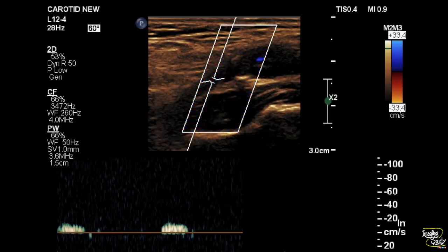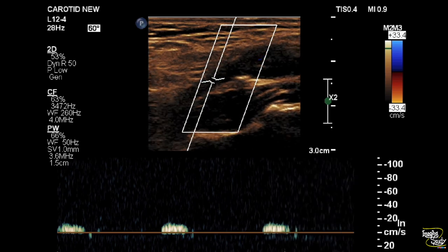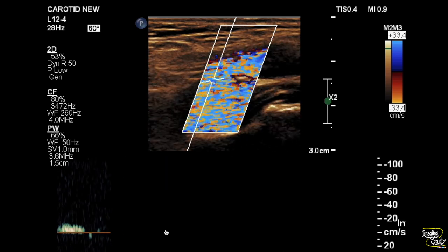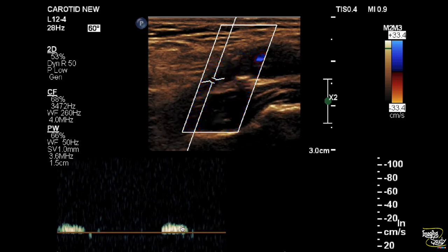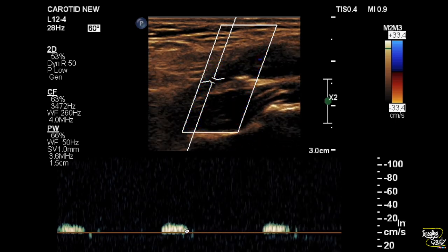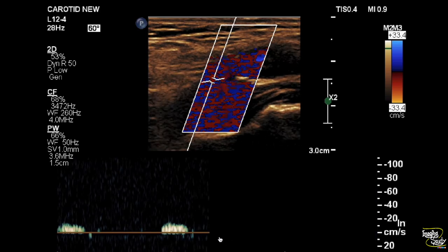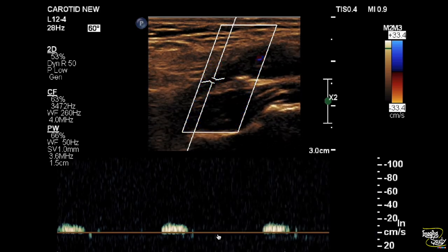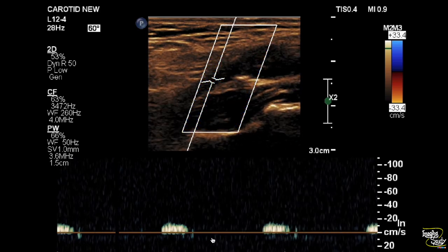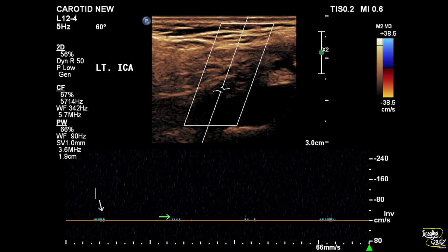Here we have taken a sample and you can see a very small amount of monophasic flow with absence of the diastole component. We tried to go a little further and you can see the flow became more reduced, almost absent.